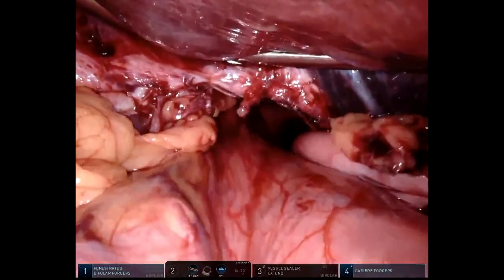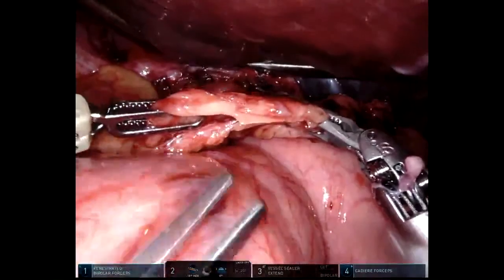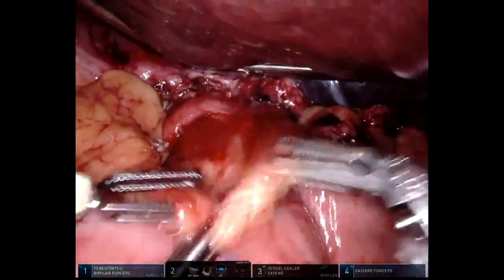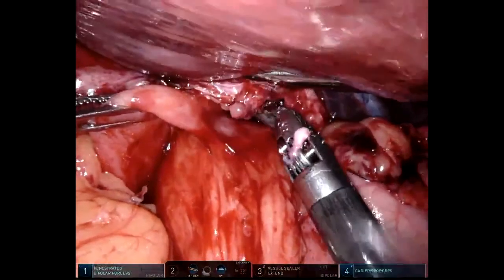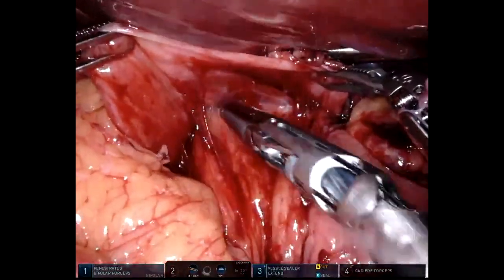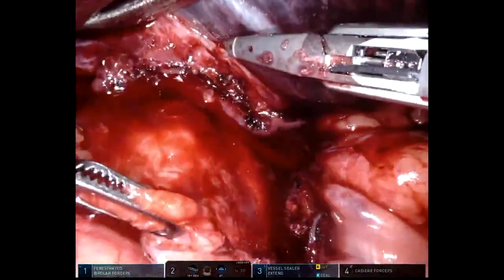We proceed to see how well the stomach is able to be reduced. The assistant now grabs the hernia sac and we proceed to dissect it out, as that represents the main principle for an adequate repair of a hiatal hernia. Otherwise, the chance of recurrent incarceration is very great.